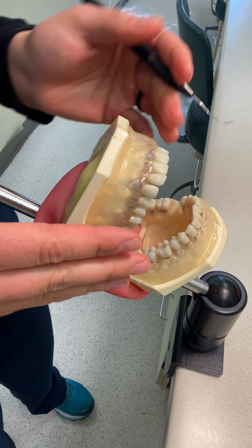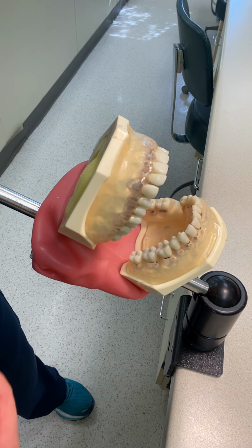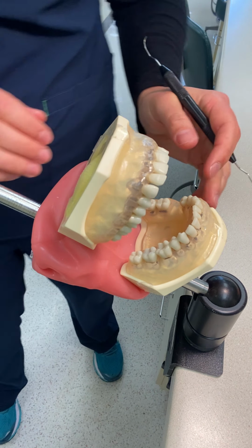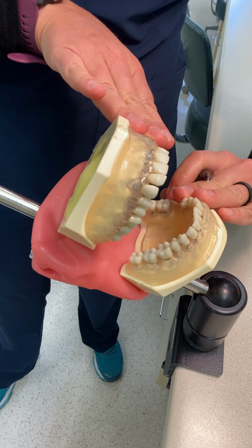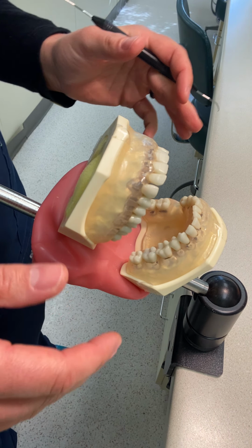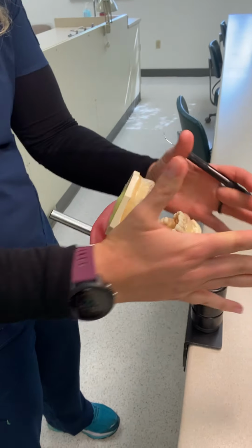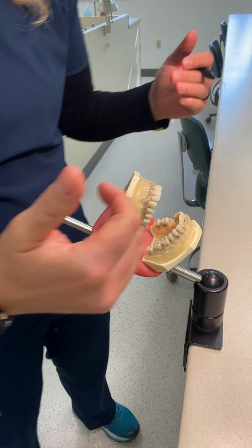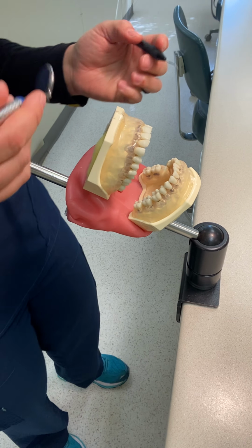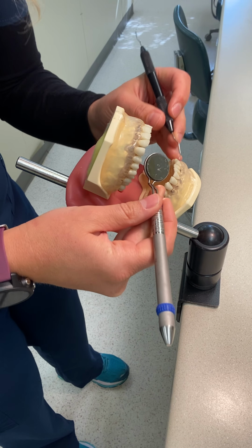Whenever you're treating, when you treat your surfaces toward, you're going to sit for right-handers down here at more like 8 or 9 o'clock. Left-handers for treating surfaces toward are going to sit more over here for their 4 o'clock, 3 o'clock area. Then for both, whenever you're treating a surface that is an away for you, you move up to 12 o'clock. So then I'm straight up from here rather than being down at the sides. And so as an example, I'm a left-handed person. And so when I'm at 12 and I'm working, I've got my mirror and I've got my Explorer and I'm working.